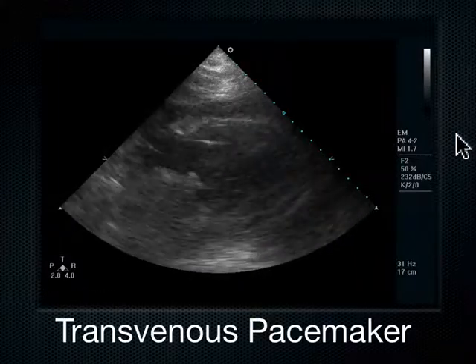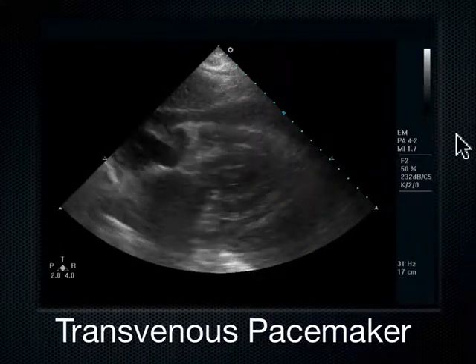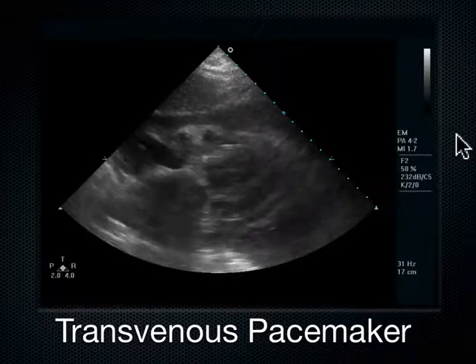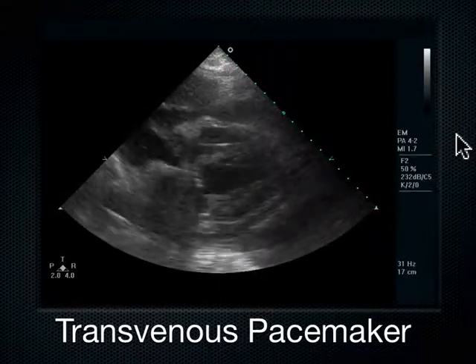So that's what a transvenous pacemaker looks like. It's just something to consider if you're in the heat of the battle and you're trying to float this transvenous pacemaker somewhere wherever you are. Think about looking at it under ultrasound guidance so you can turn it and guide it to get it in that spot. Those pacing wires make very good reflectors of ultrasound.